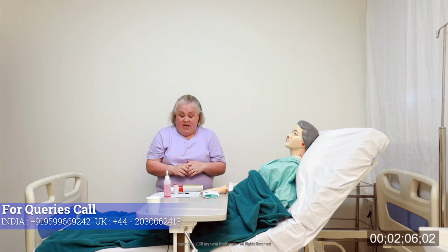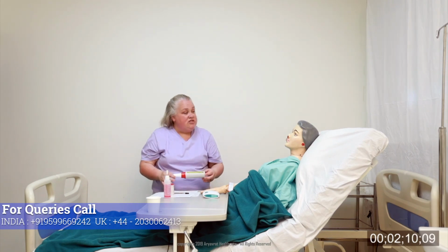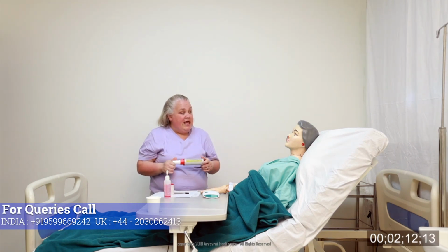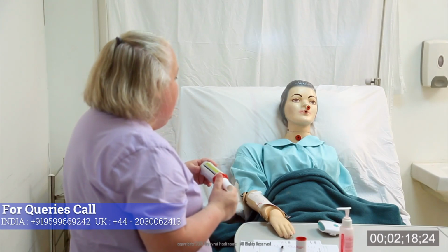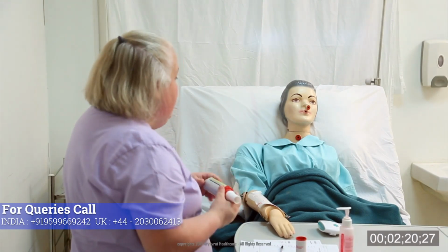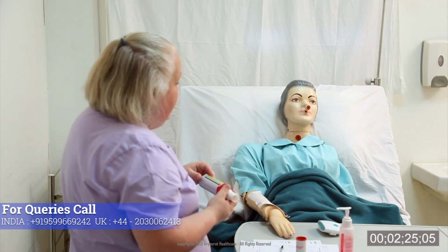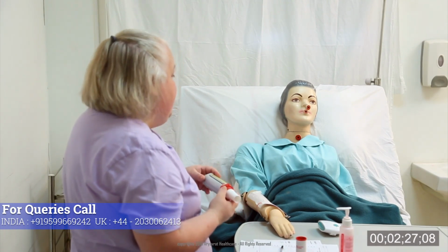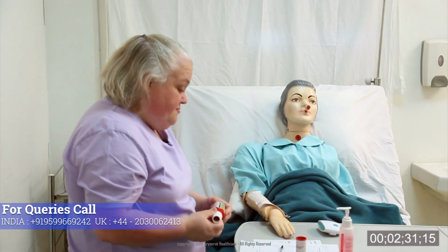Yes. Okay. Because it's important that we get a good measurement before and after your medication twice a day. So once we've shown you how to do this, we would like you to keep a record of your measurements before your medication in the morning, half an hour after your medication in the morning, and then before your medication at night, and again half an hour at night. Does that make sense? That does.